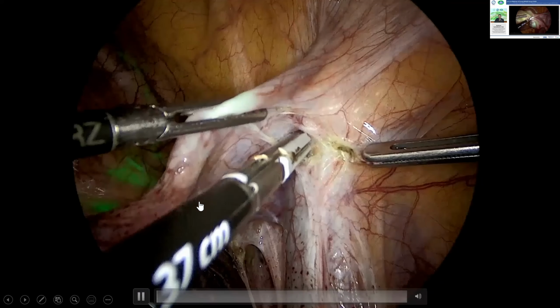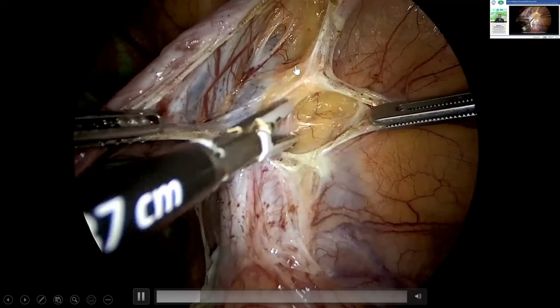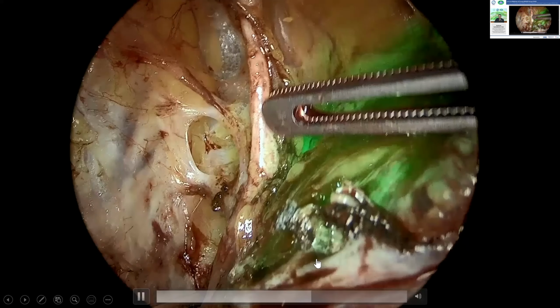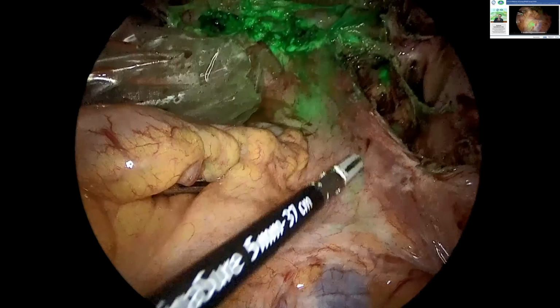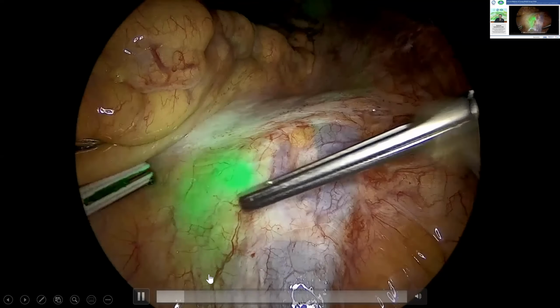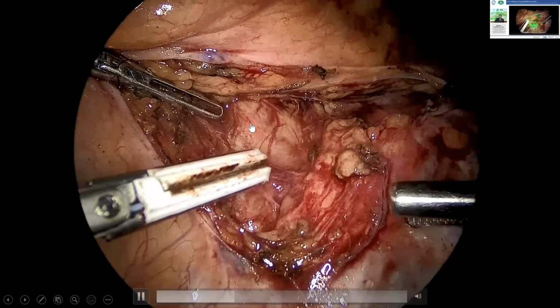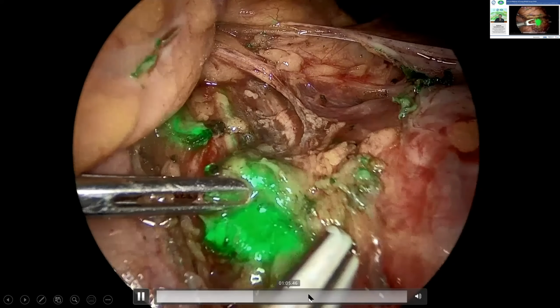I will show you some. It is quite difficult, as there was some adhesion from the pelvic lymphadenectomy performed 5 years ago. In my experience, when we perform sentinel lymph node mapping, we will see lymph nodes we have to remove in what we call atypical regions, especially in the presacral area. You see here, this is the bifurcation. You see the lymphatic trunk here. This is the sacral area. You see the lymphatic trunk going to the presacral lymph node. This is very clear. We have to remove this one.